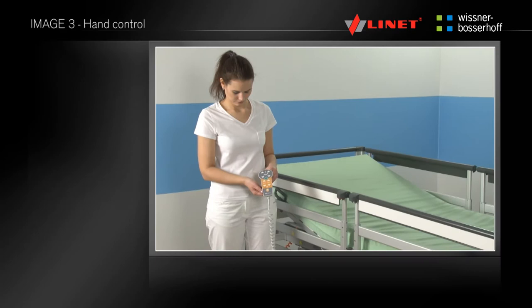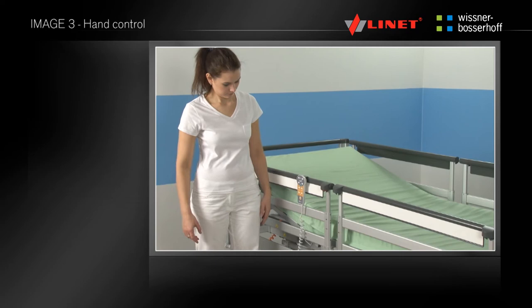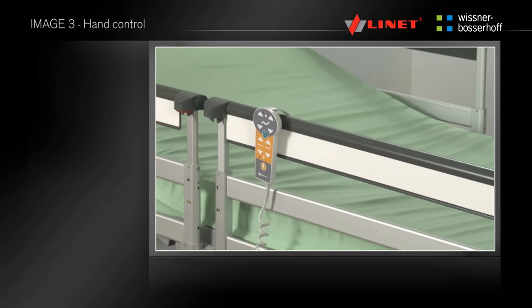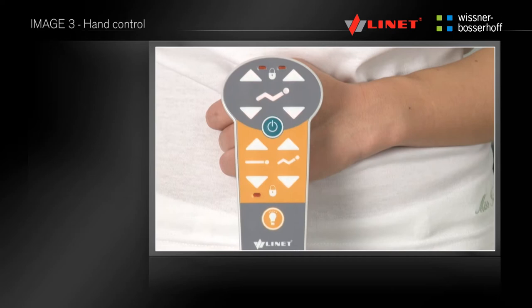You can hang the ergonomic hand control on the outside or inside of the head side rail, or on the foot side rail. The hand control is intended for patients and staff, and has a flexible cable that allows flexibility. Before positioning, please activate the bed using the go button.